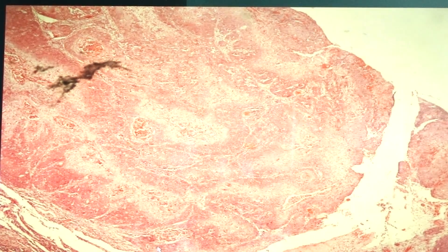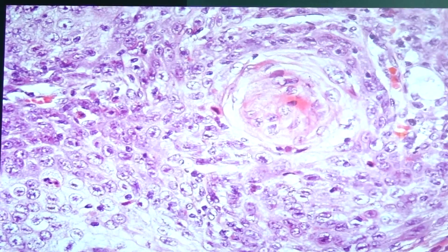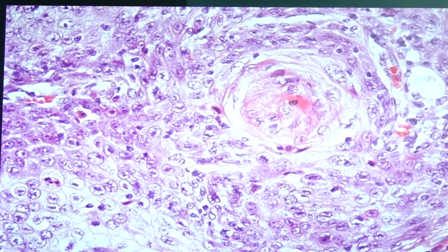So, there are two types of squamous cell carcinoma. And we are going to look for this particular structure. What is this one? That is keratin pearl. If you see the presence of keratin pearl, wherein you have the presence of whirling pattern, presence of keratin, and entrapped squamous cells, this is falling under the keratinizing type.